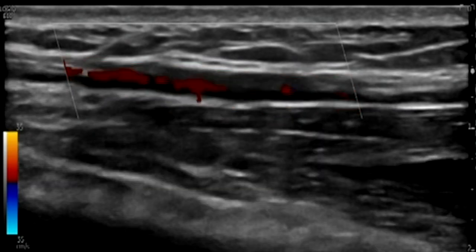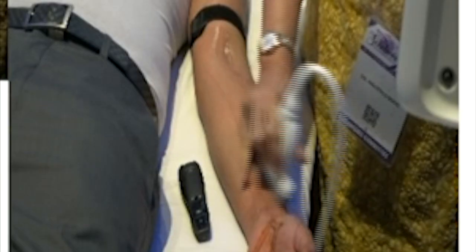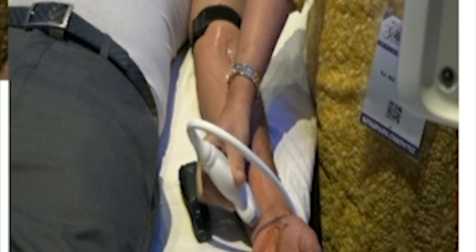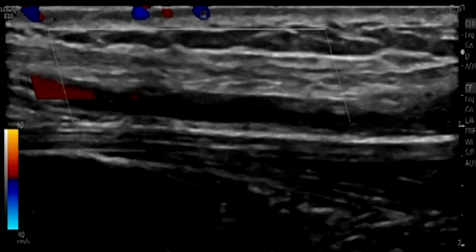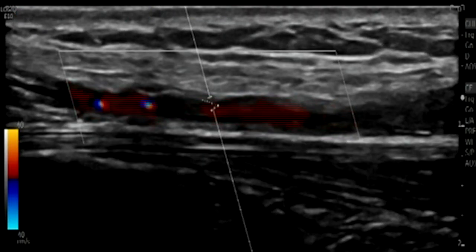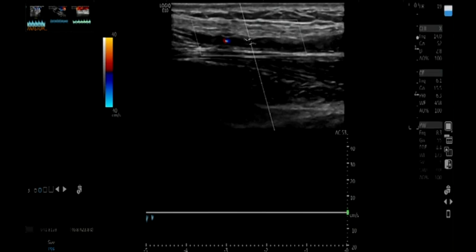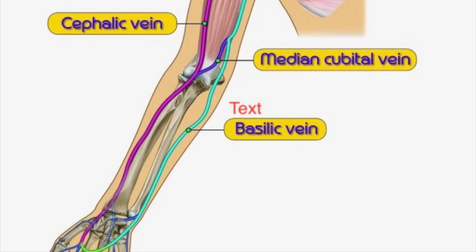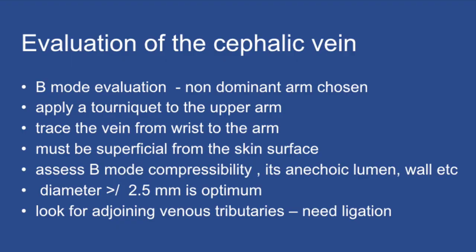After these two tests confirm there is no distal vascular compromise, it is also prudent to sample the ulnar artery. Once the radial is given away for the fistula, you need to confirm the ulnar artery is also providing good flow. The ulnar artery evaluation is done here and is normal.